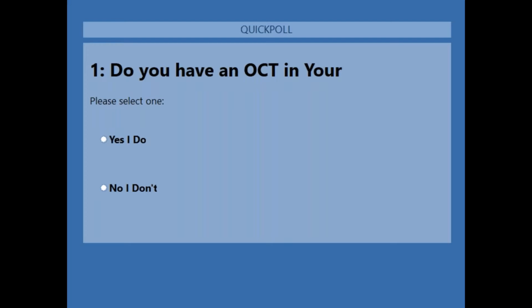And we're going to give you, there we go. The screen should have went black for you, and then you've got a couple of choices there. And the polling is in progress. This is an interesting question. I've lectured on OCTs for the last 8 or 9 years, and I've asked this question for most of them, and it's been fun to see the responses.